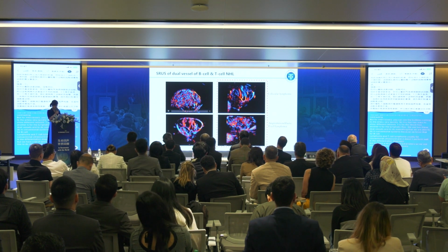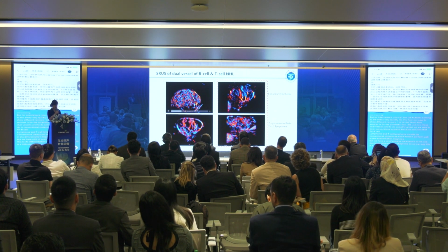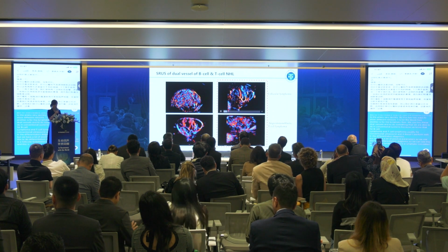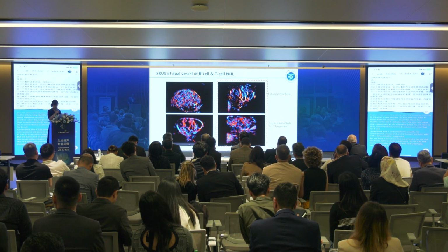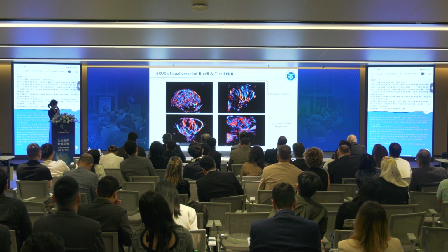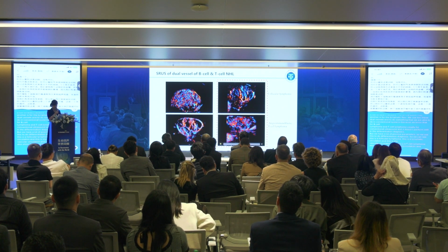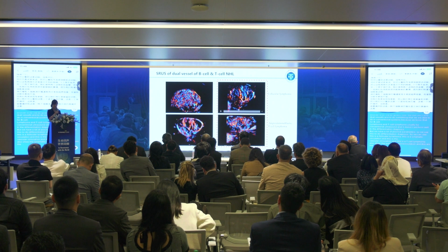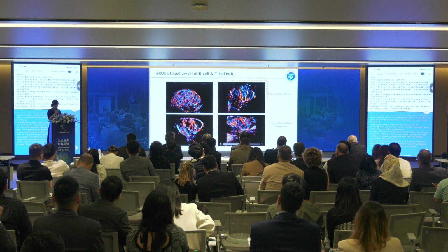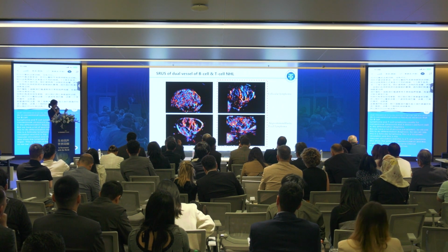So we can see this is a follicular lymphoma. This is a lymphatic circulation, and this is the vascular circulation. And this is a T-cell lymphoma, also showing the lymphatic microcirculation. And this is one case of the same lymph node, so we can compare these two different circulations.